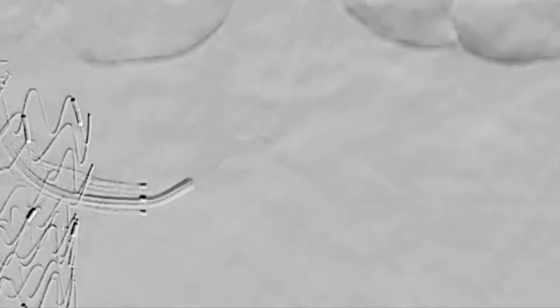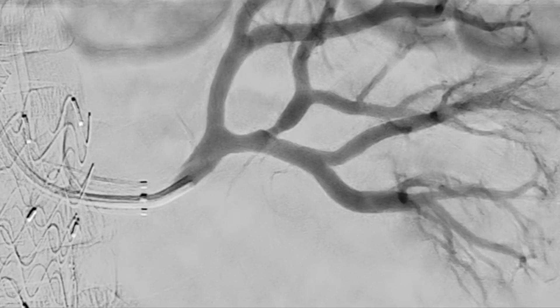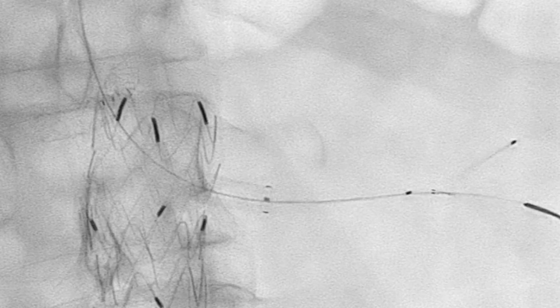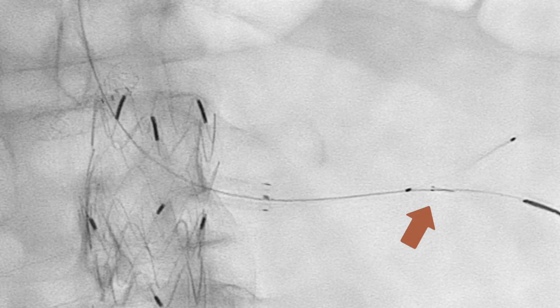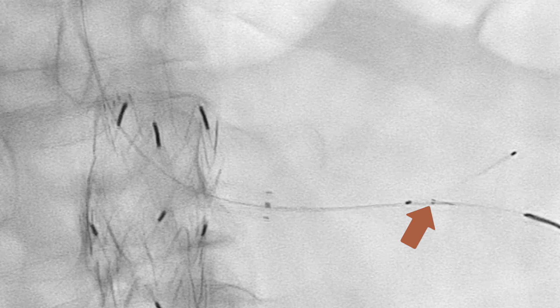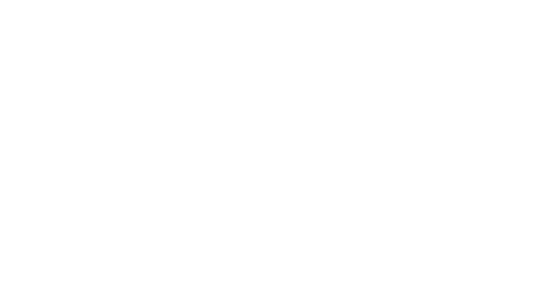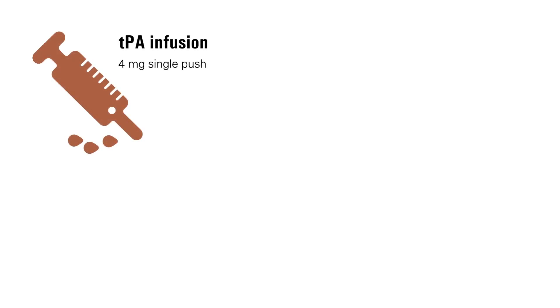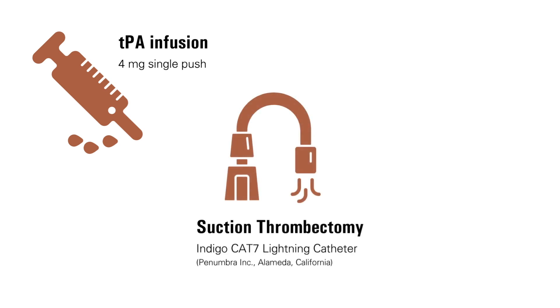We then performed selective angiography and confirmed patency of the distal renal vasculature, as shown here. Following this, we prepared for suction thrombectomy by placing a 5mm SpiderFX embolic protection filter. We also introduced an O18 steel core buddy wire into the left renal artery. Once the filter was deployed, we infused 4 mg of TPA and performed suction thrombectomy using an Indigo Cat7 Lightning catheter.